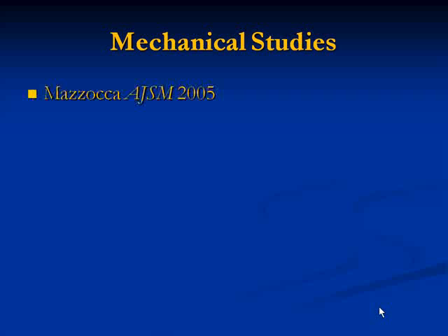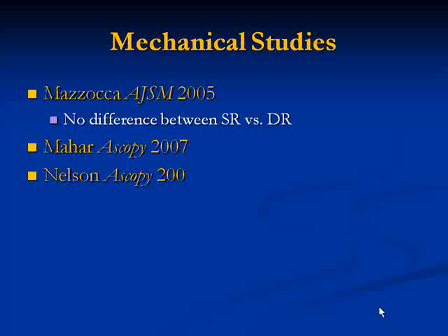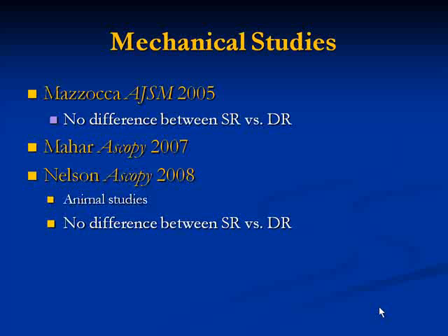On the other hand, Mazuka in 2005 did a mechanical study and did not see a difference between single row and double row as far as strength. And Mahar and Nelson did studies also showing no difference. These were done with animal specimens, unlike the other studies with the human specimens.